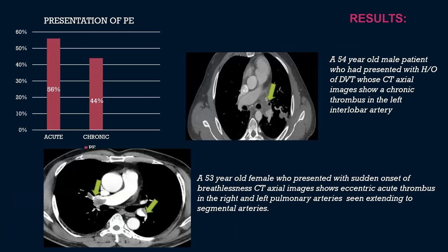Among patients with pulmonary embolism, 56% had acute embolism and 44% had chronic embolism. A 54-year-old male who presented with history of DVT showed on CT axial images a chronic thrombus in the left interlobar artery. A 53-year-old female who presented with sudden onset of breathlessness showed an eccentric thrombus in the right and left pulmonary arteries, extending into the segmental arteries as well.